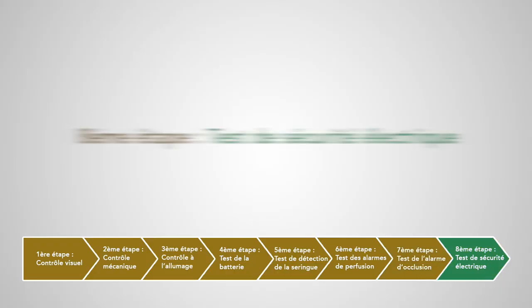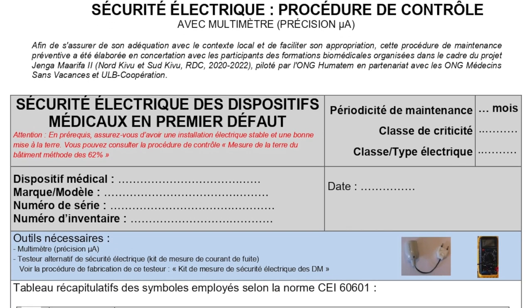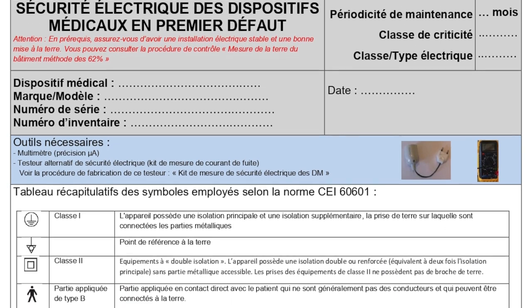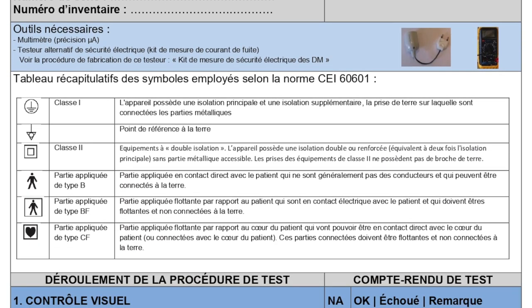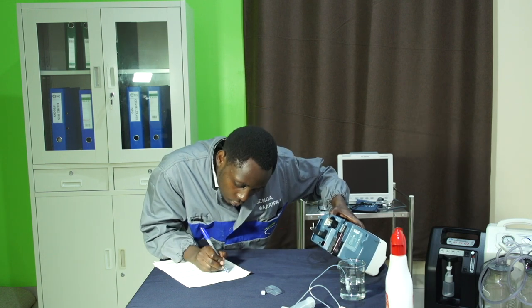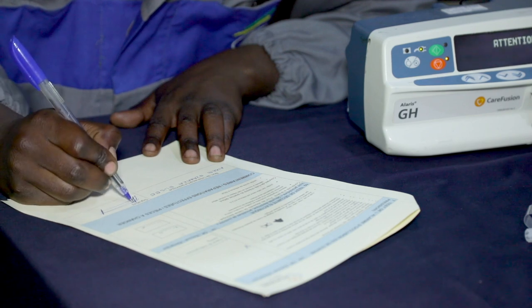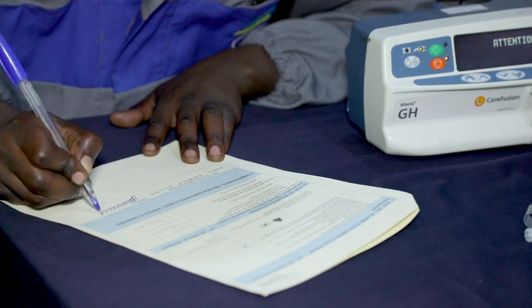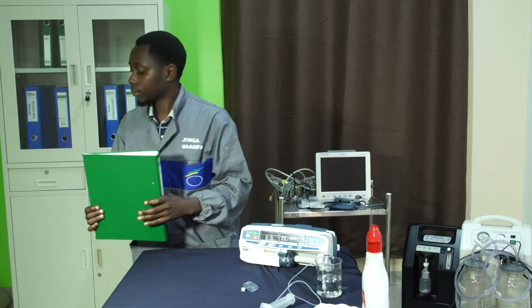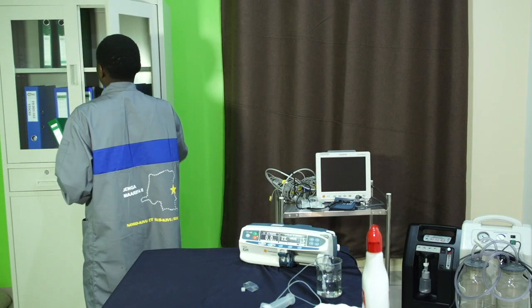Huitième étape : test de sécurité électrique. Nous vous renvoyons directement vers la procédure de sécurité électrique que vous trouverez aussi en lien sous la vidéo. Une fois que nous avons vérifié notre appareil en suivant toutes ces étapes, n'oublions pas de compléter et d'archiver les comptes rendus et d'enregistrer les résultats de cette maintenance dans nos outils de suivi. L'appareil ne peut être rendu au service utilisateur que si et seulement si toutes les étapes sont validées.